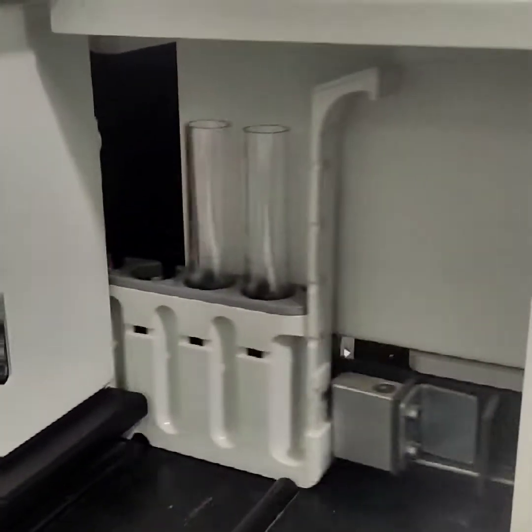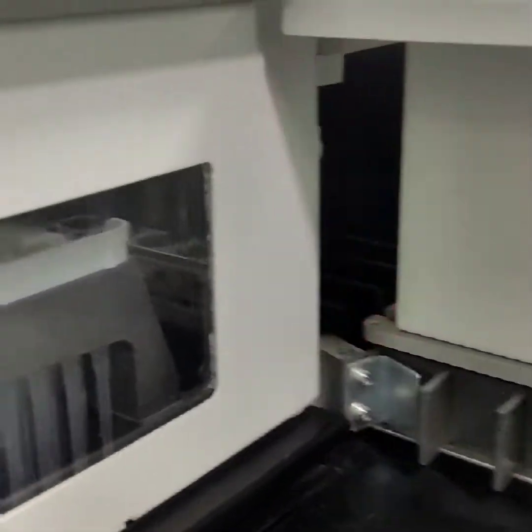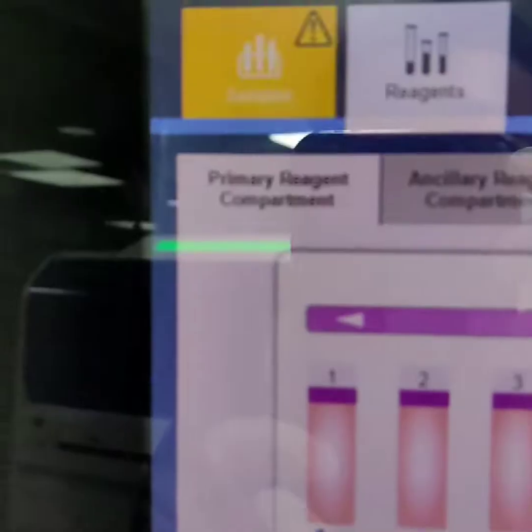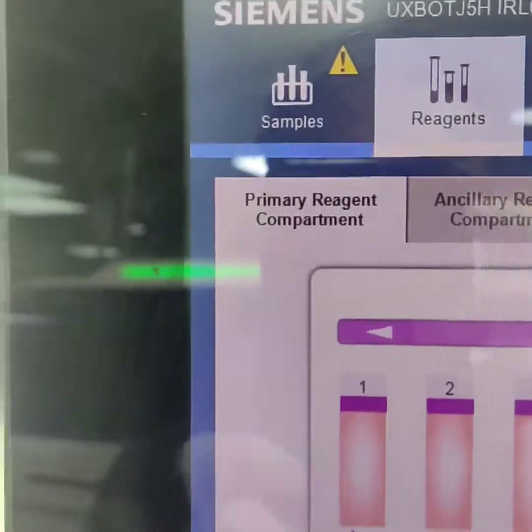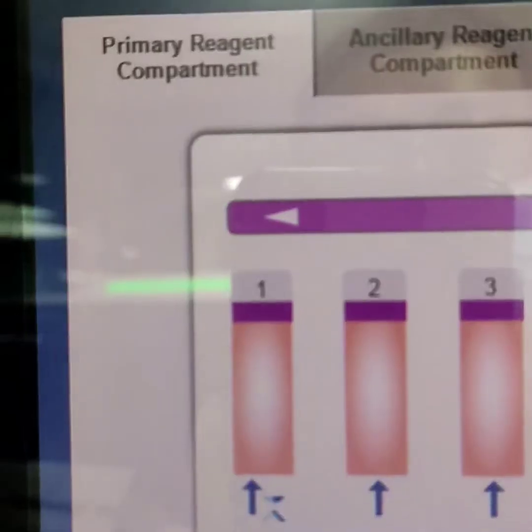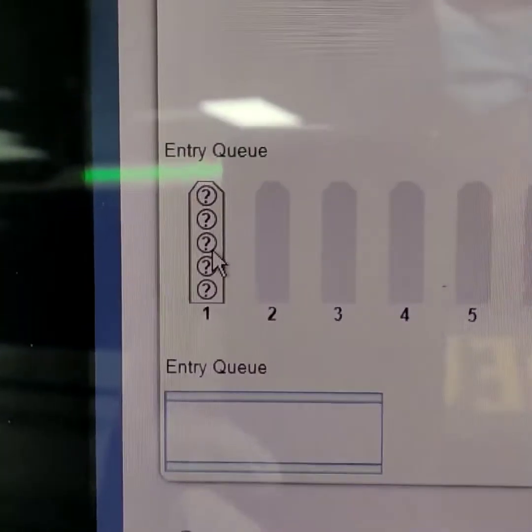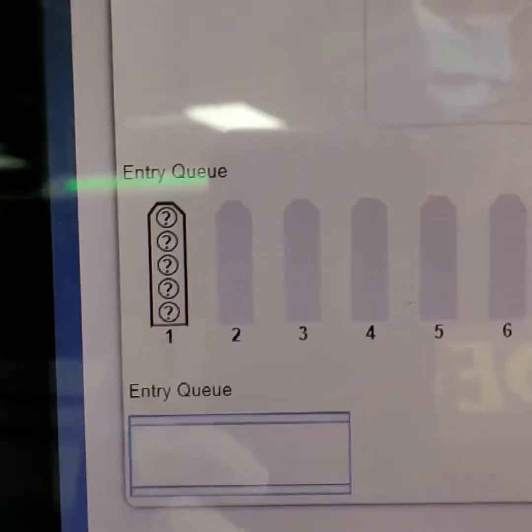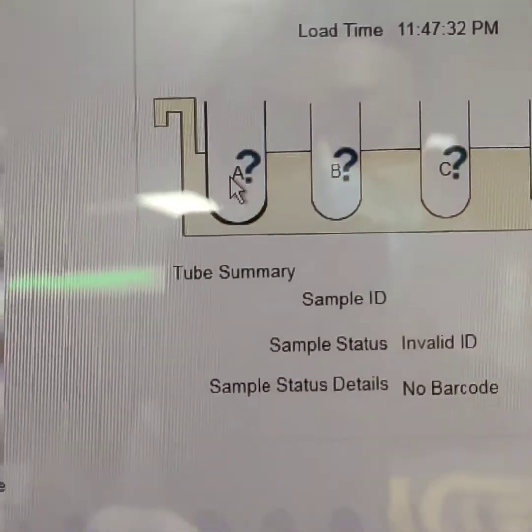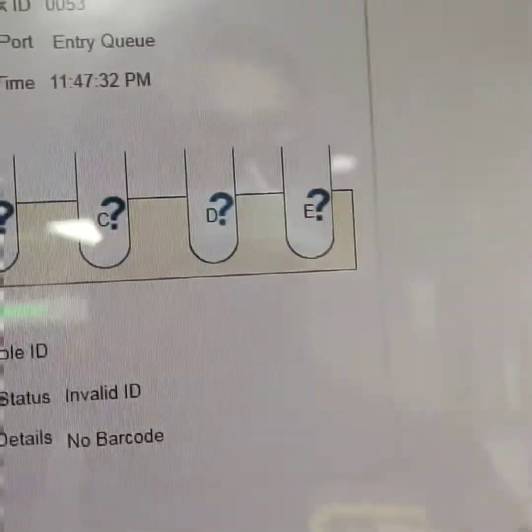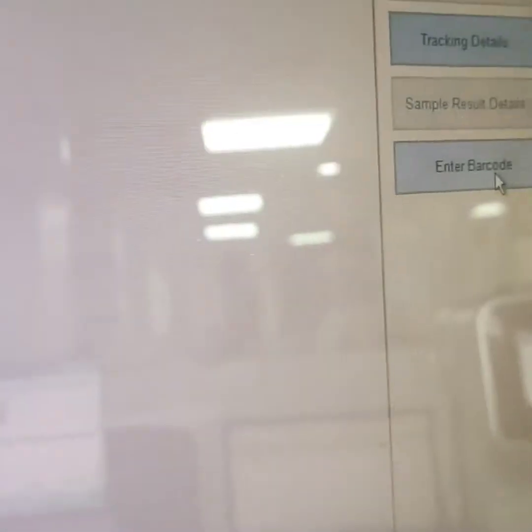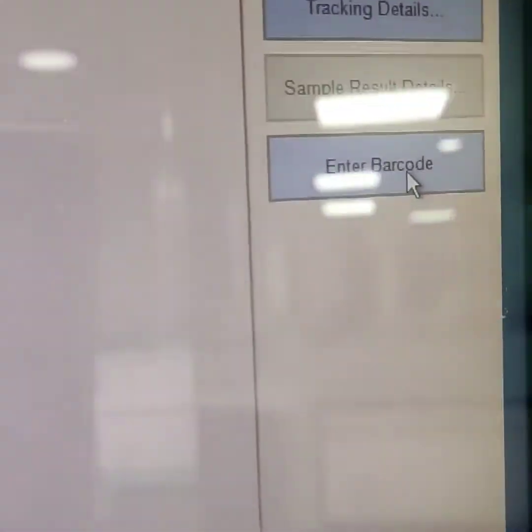As the rack moves inside the machine, a yellow signal blinks at the sample icon on the home screen. We go to sample and again we have to define calibration by entering a barcode, so we go to the enter barcode option and choose calibrator.